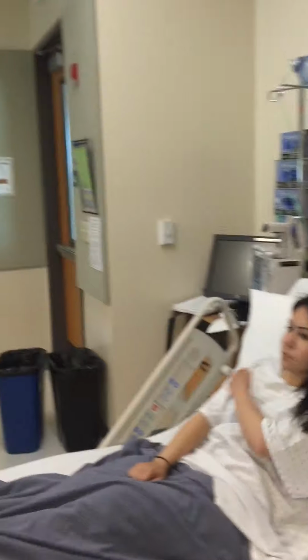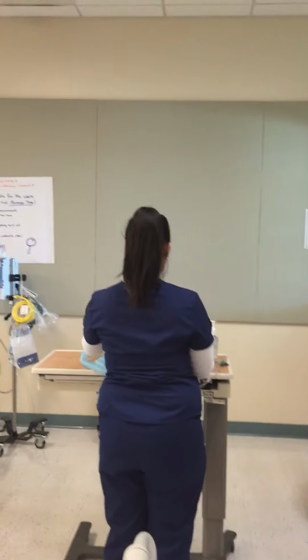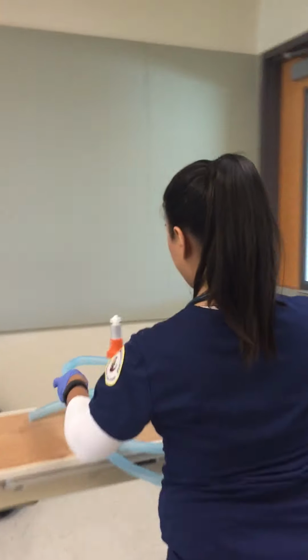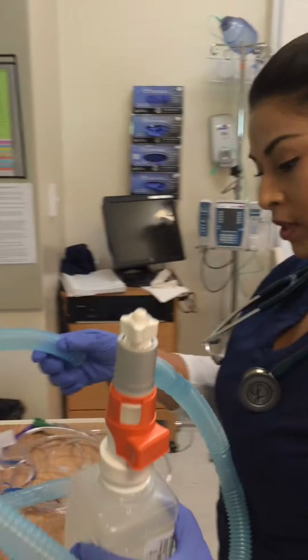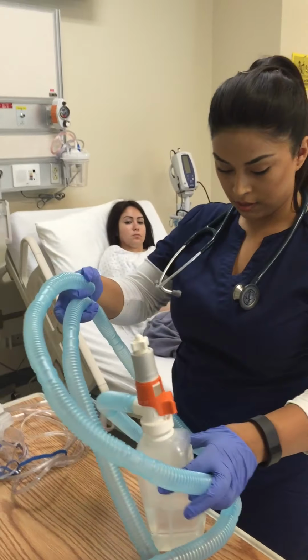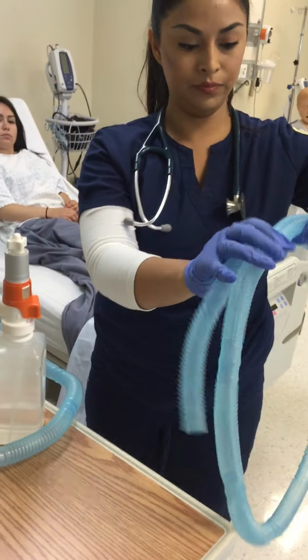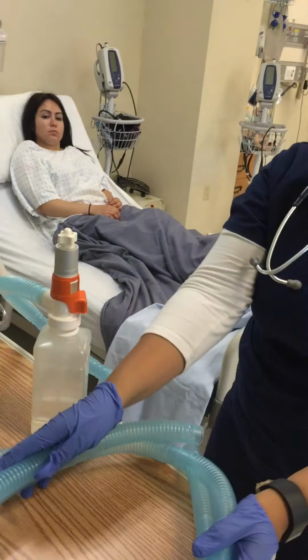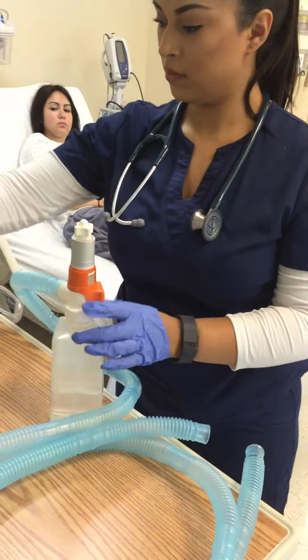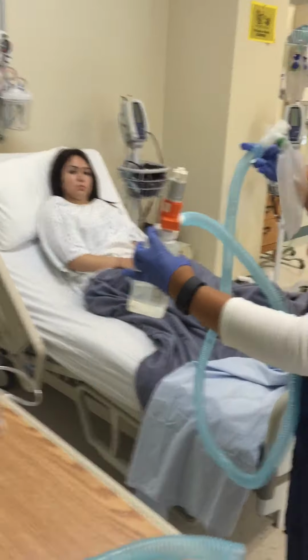Okay, so now I'm going to go ahead and get everything ready. First, I want to try to not contaminate the tubing. Make sure I got the right one. Okay, so I'm going to get my large volume from the water trap.